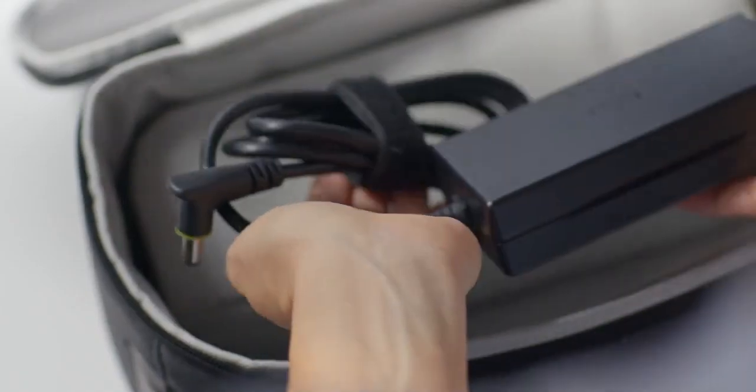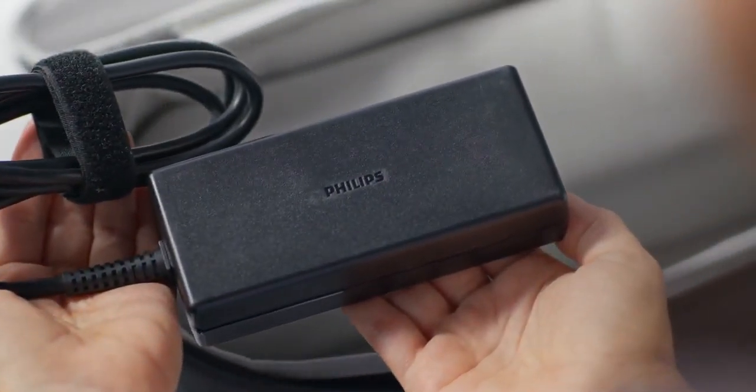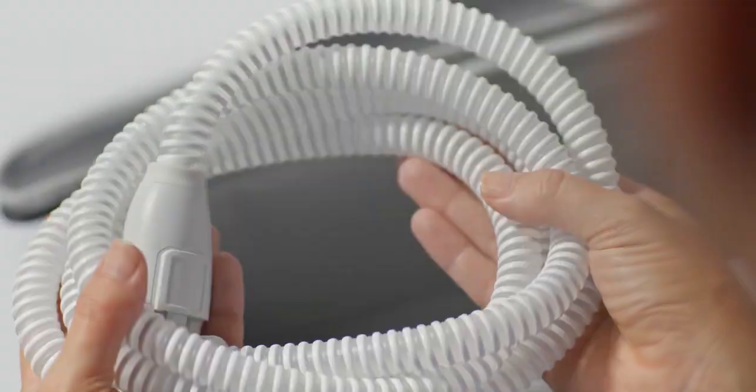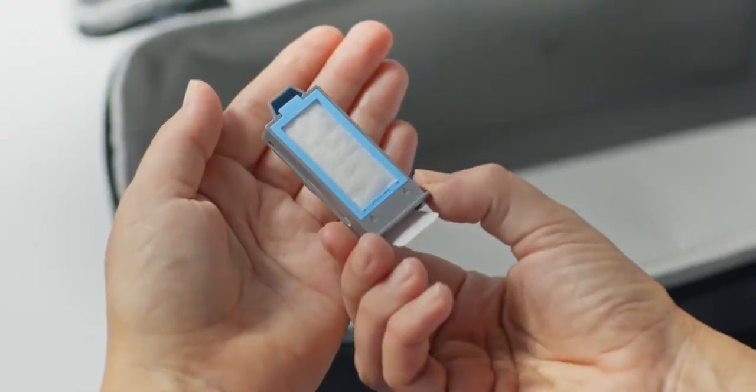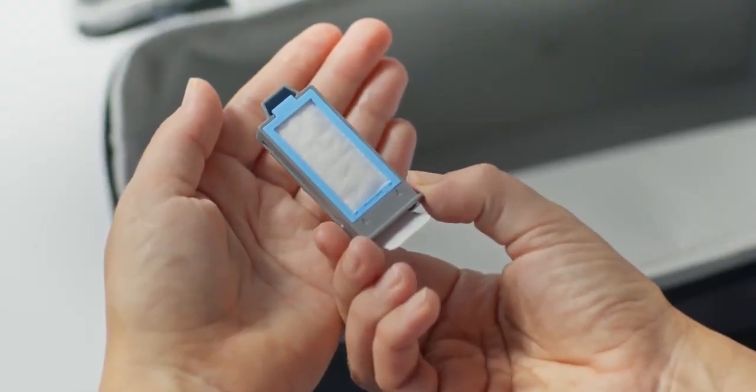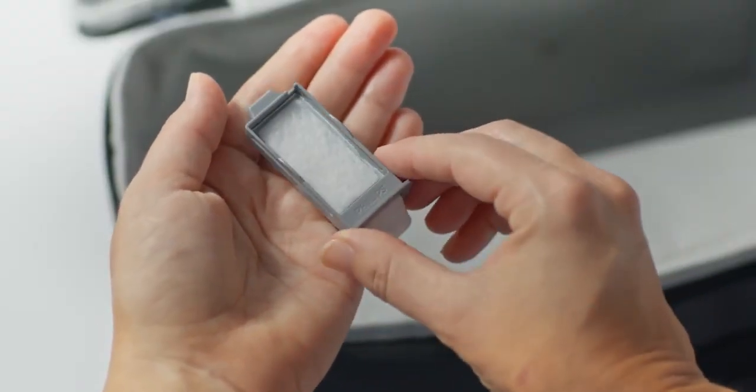For setup, you'll need the power supply and power cord, tubing and filters that came with your device. You'll also need your prescribed mask.